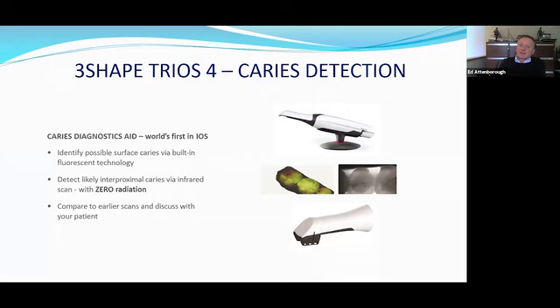The other thing that's quite nice is that, particularly with some of these infrared or near infrared technologies, they can penetrate slightly deeper than the actual surface of the object being scanned. And this helps in scanning subgingival preps which normally you'd have to use retraction cord for. You still do, but it makes it better and more accurate.